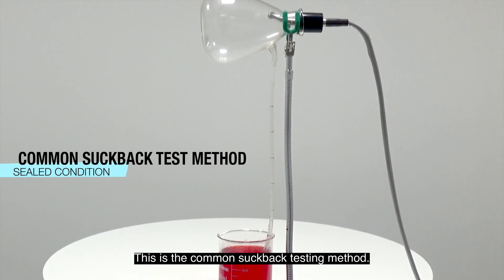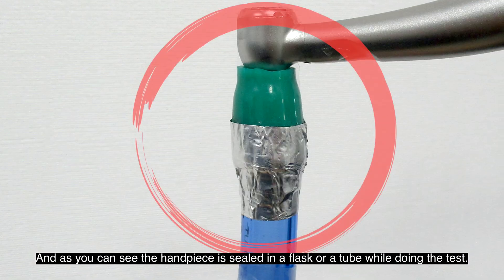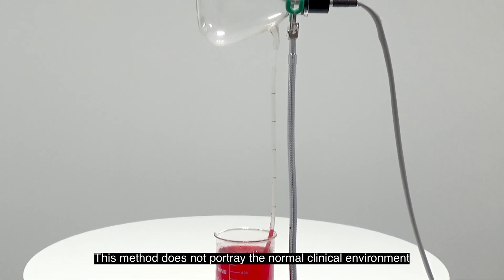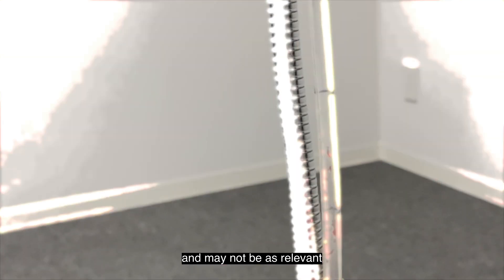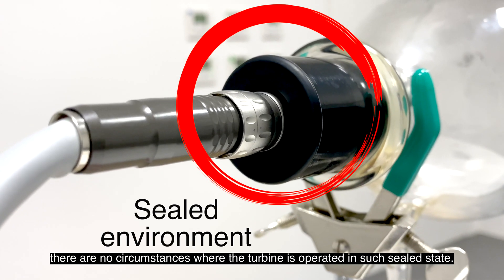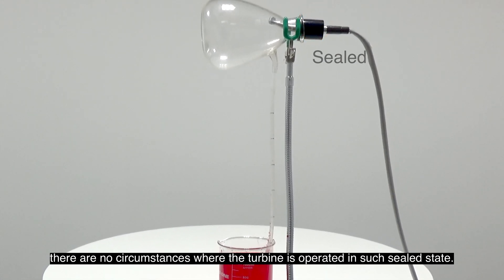This is the common suckback testing method and as you can see, the handpiece is sealed in a flask or a tube while doing the test. This method does not portray the normal clinical environment and may not be as relevant, since during a normal treatment procedure there are no circumstances where the turbine is operated in such a sealed state.